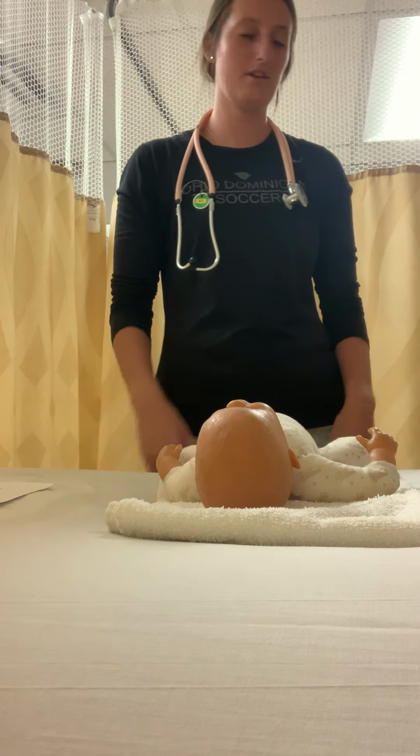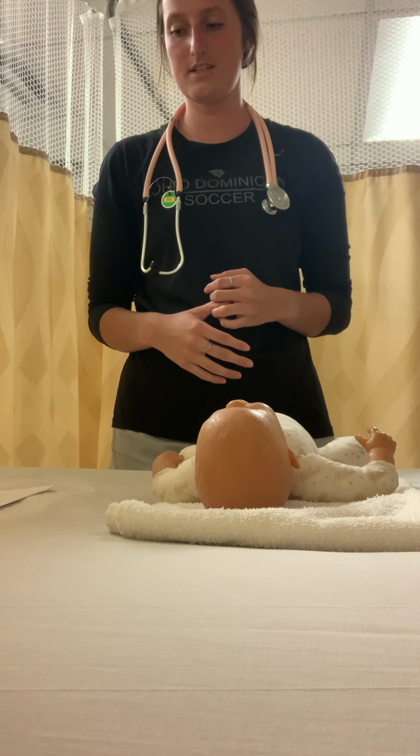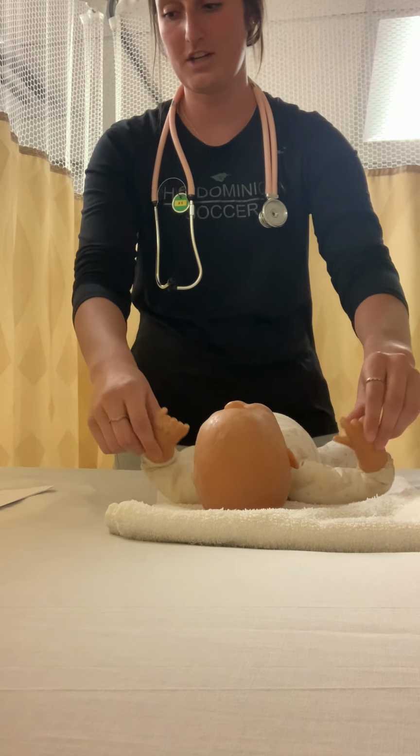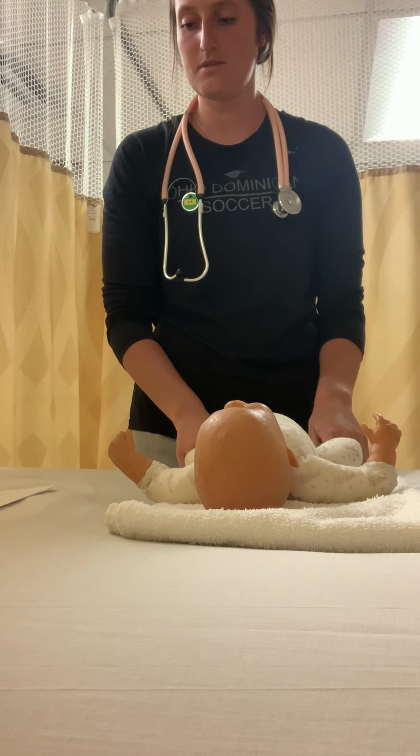I would then place the baby in a warm environment in the radiant warmer. I would visually assess the baby. I would check its posture, flexion at the elbows, the hips, and the knees is normal. Posture tells us about the baby's muscle tones.